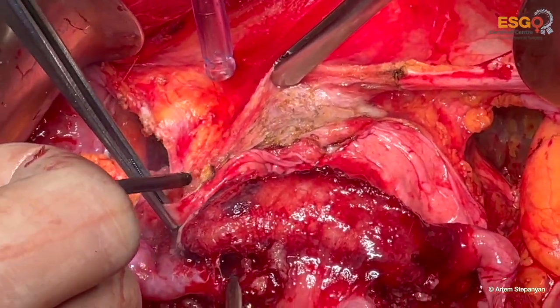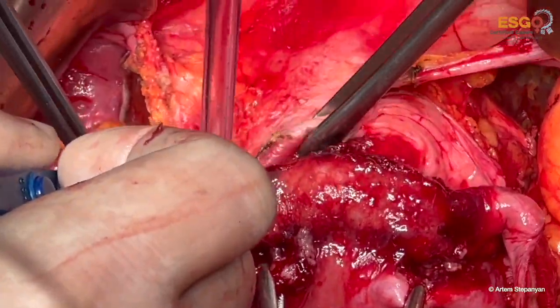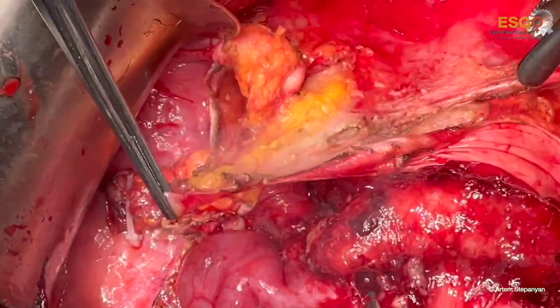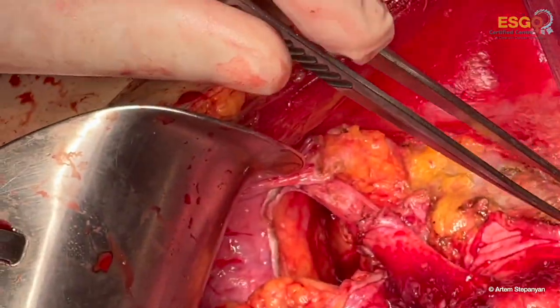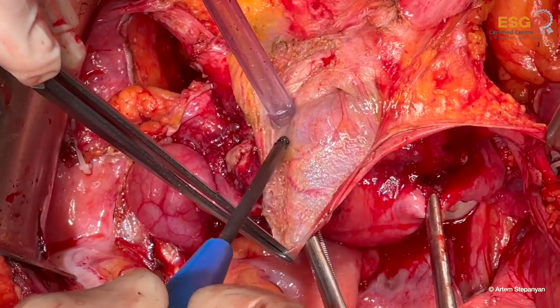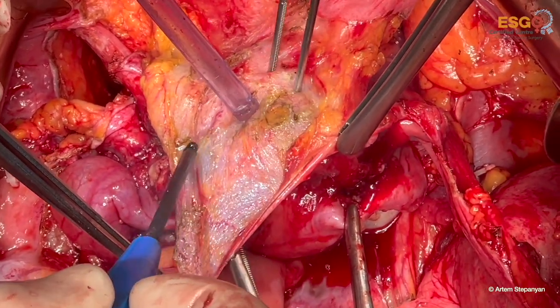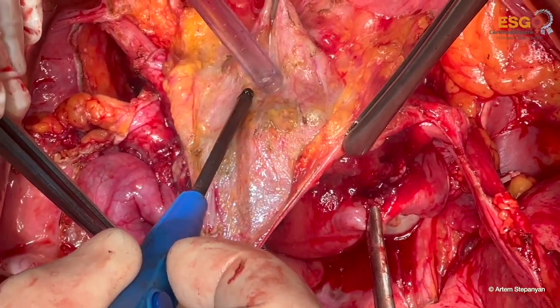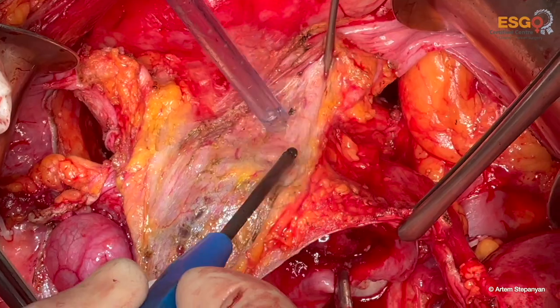Now we strip away the peritoneum from the bladder. We see a good amount of infiltration of the vesicovaginal space, vesicovaginal fold. But it's very rare that the ovarian cancer infiltrates the bladder muscle.